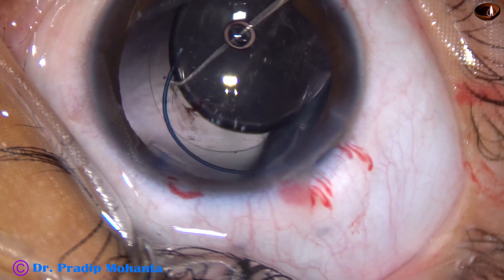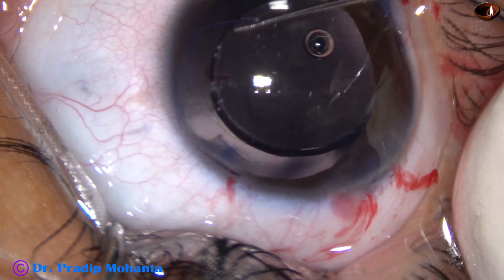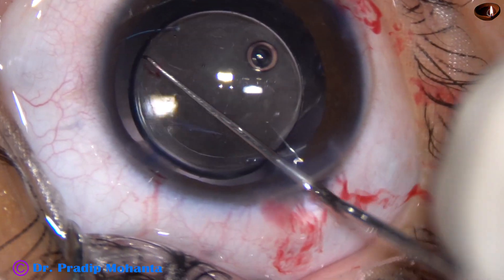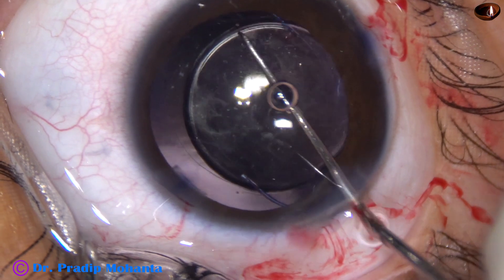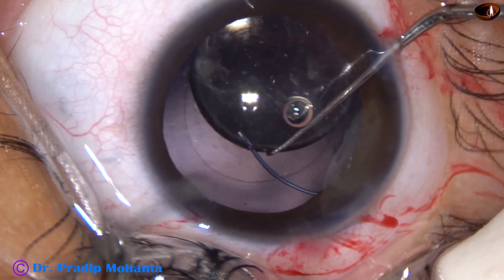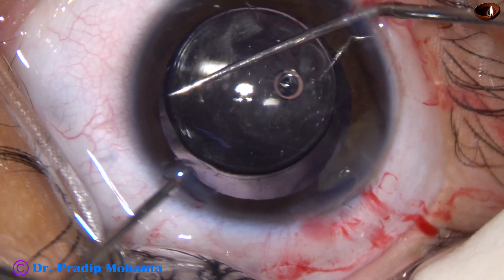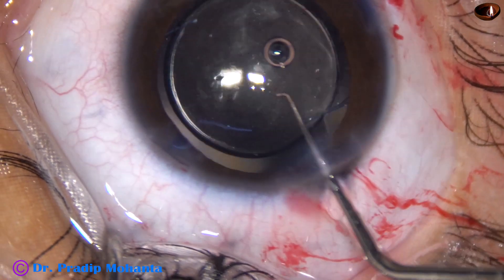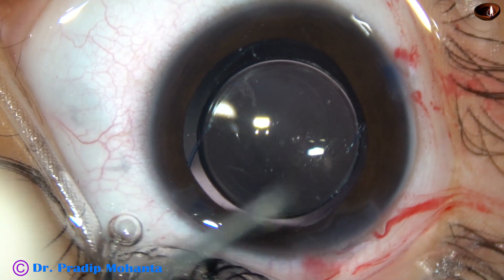I try to dial this haptic into the capsular bag but it didn't go. So what I do is I dial the lens 360 degrees, bring the trailing haptic again at 12 o'clock, and now I go through the right side port with the Sinskey and take a blunt chopper to help this haptic go into the capsular bag. Yes, the haptics are in the capsular bag. These multipiece lenses are more stable in the capsular bag than single-piece lenses — it will never rotate.